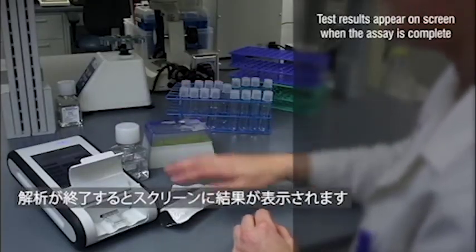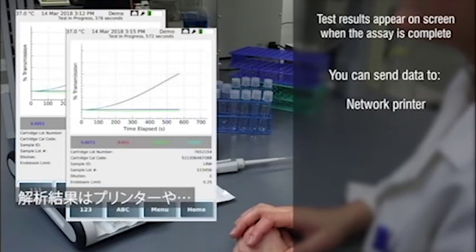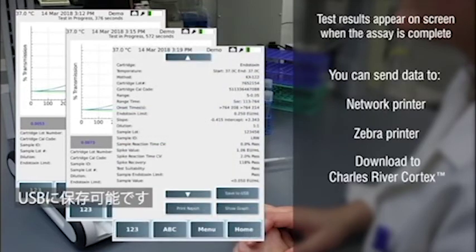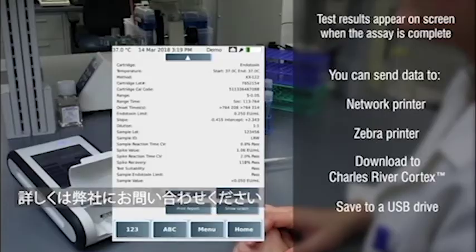Test results will appear on the screen when the assay is complete. You can send this data to a network printer, zebra printer, download to Charles River Cortex, or save to a USB drive.